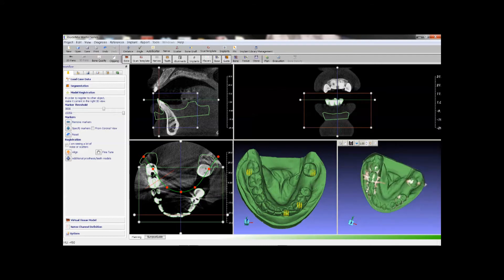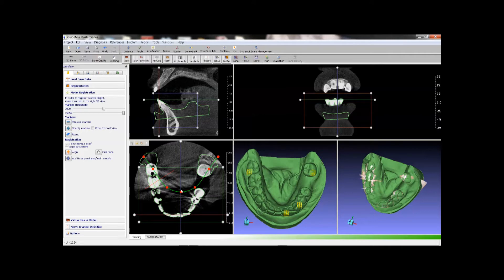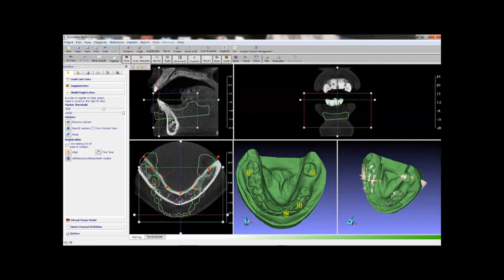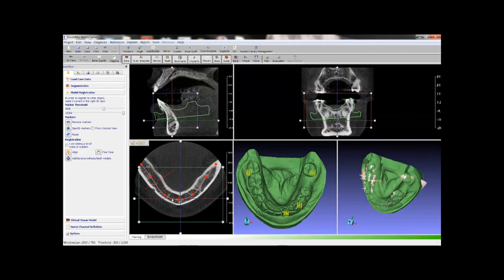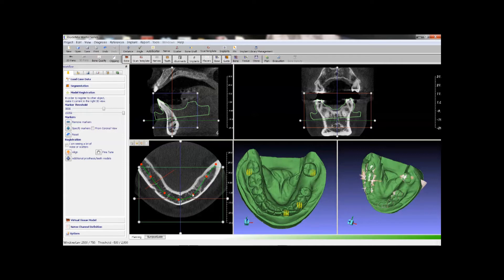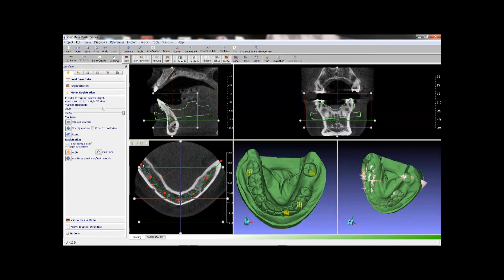Next we will create nerve model for this case. Before we do that, we want to adjust the arch curve. The nerve is about here, so we double click here to move the axial slice to this level. Drag the arch curve, adjust the handles.